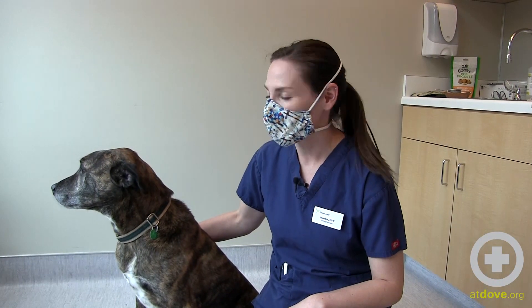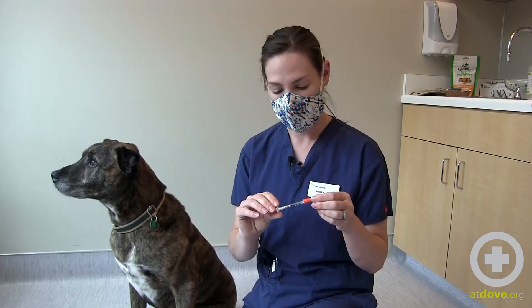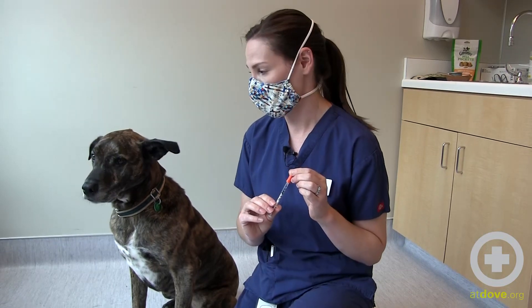Hi, I'm Jessica and I'm one of the technicians here at Dove Lewis. I'm here with Wesley and today we're going to demonstrate how to give an insulin injection to a dog. I already have my U100 syringe drawn up with the insulin we're going to give Wesley today.